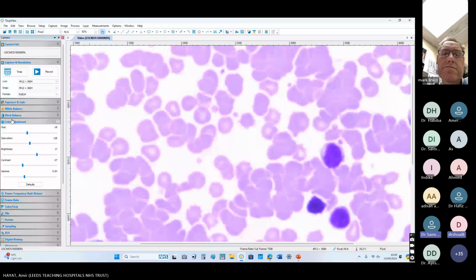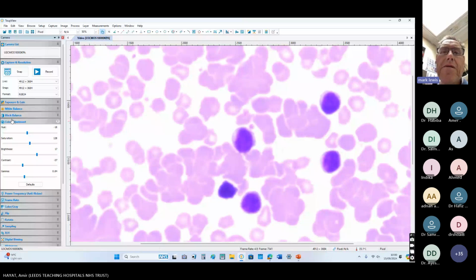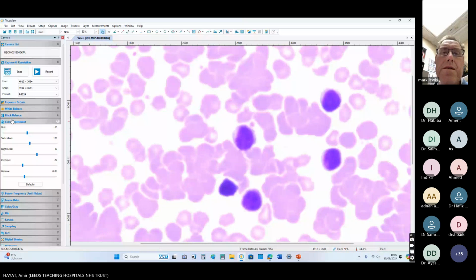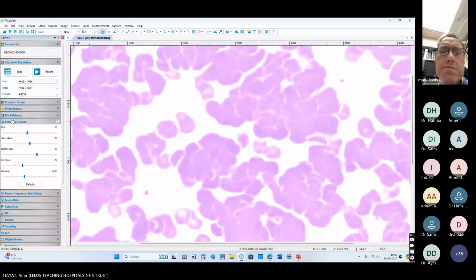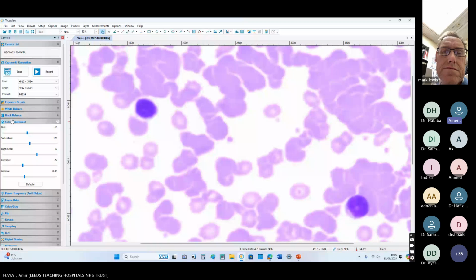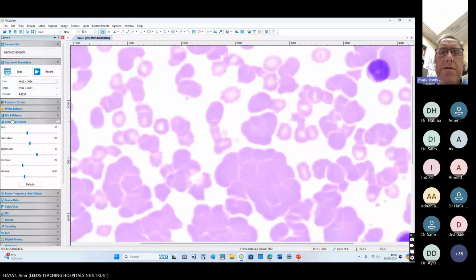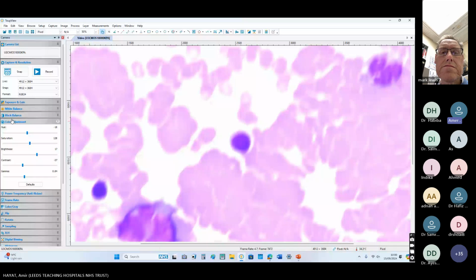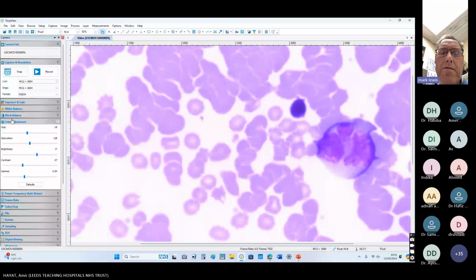There are many reactive lymphocytes. Could this be some form of lymphoma? Mycoplasma? Okay. So now you have commented that there are cold agglutinins and there are some lymphoma cells as well. Yeah, that's right. You have now referred the blood film to clinical hematology. Yeah, definitely would have sent this in. Yeah, that's a really abnormal blast cell, maybe.